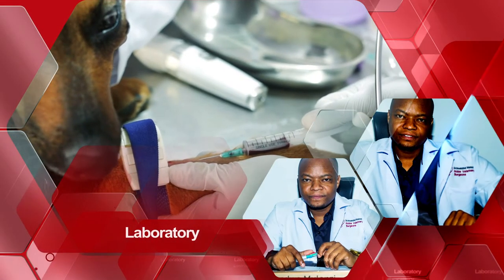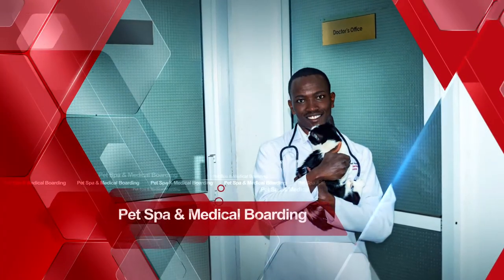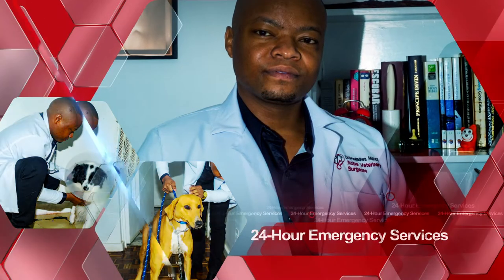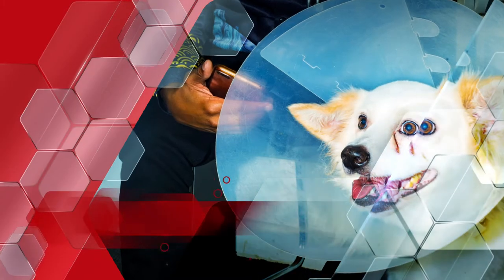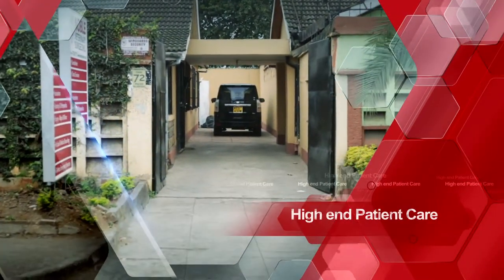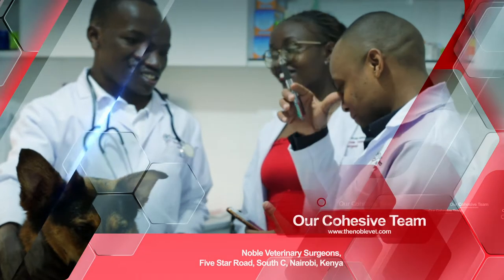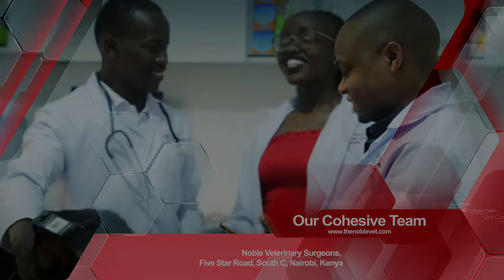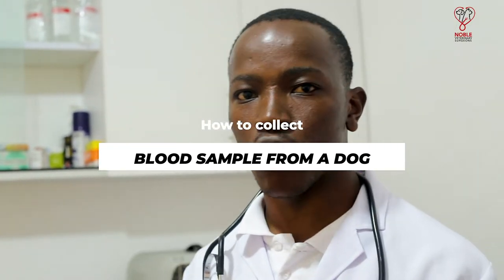Let's get started. Today we are going to take you through a collection of blood, which is done routinely for confirmation of diagnosis. I'm here with Dr. Rose Moncoma, my name is Dr. Dan, and our patient today is Diva.